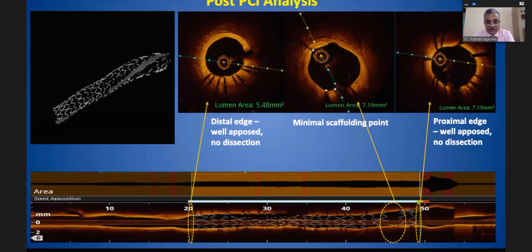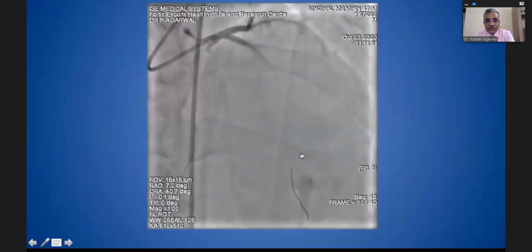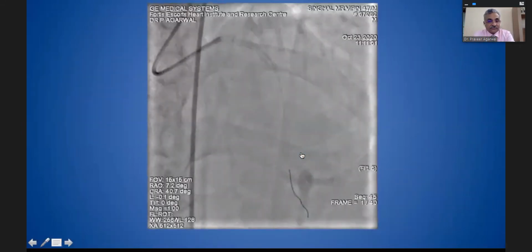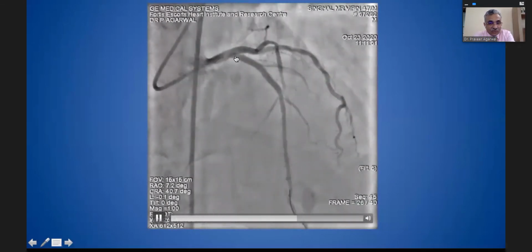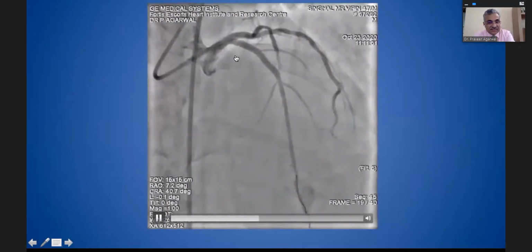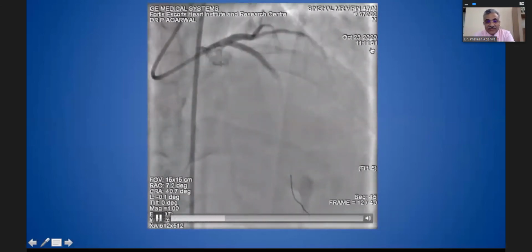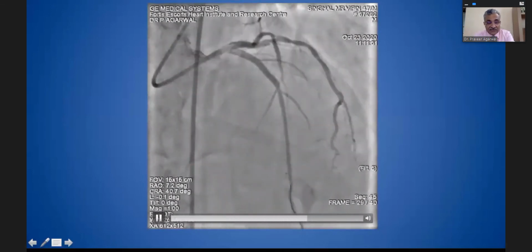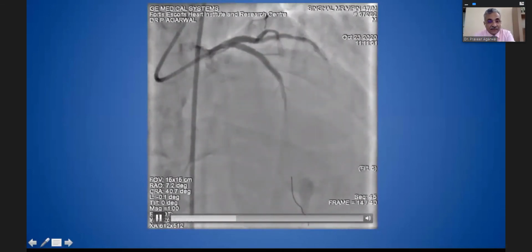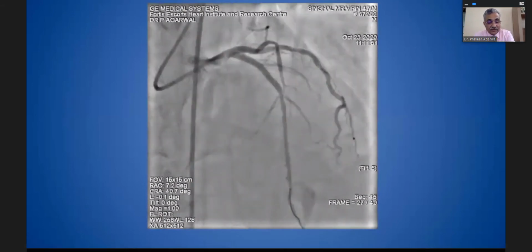So you are concerned that this proximal edge is one thing that you don't want to just leave like that. But still, we took a picture. The picture is looking reasonable. You can see some areas, once you've seen an OCT, it looks slightly more maybe hazy, just as a thought. But we left it there. And this was done in October 2020. The patient's still doing fine. So what the clinical significance of this finding is, I'm not sure. But still, it is to be noticed that the stent got elongated in the proximal segment.